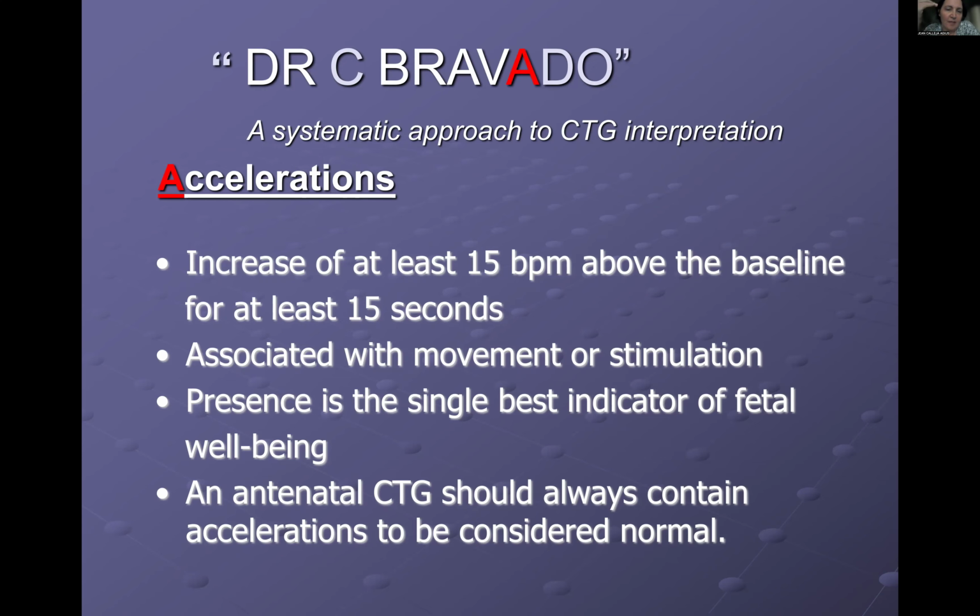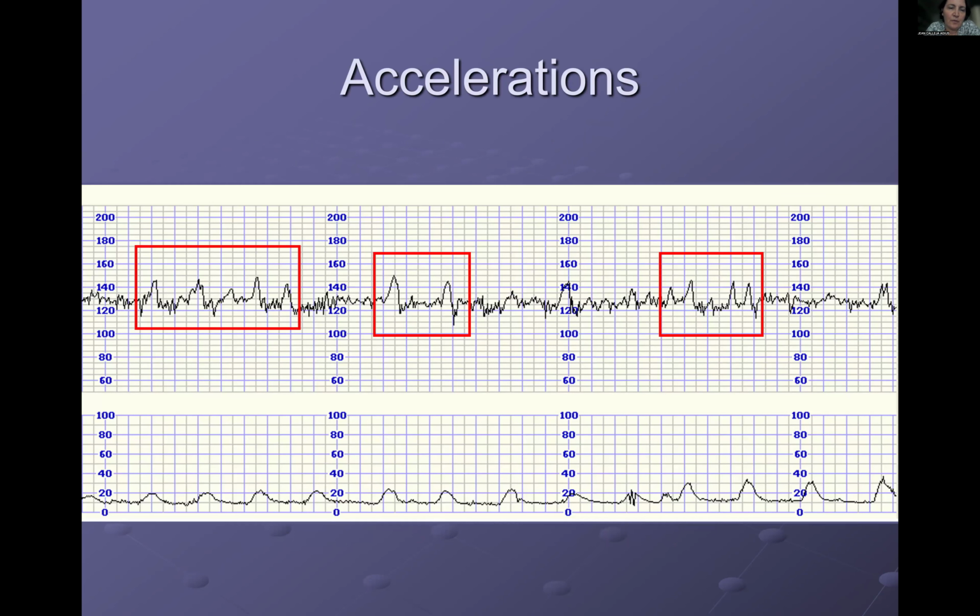And ideally, an antenatal CTG, right, should contain accelerations. Especially if she's in the early stages of labor or prenatally, like you're listening in. So normally, if a lady has come in, for example, because she hasn't felt the baby move and you're doing a CTG, as I said, you give her 20 to 30 minutes, like in this case, we give her 30 minutes. And just in case the baby happens to be a bit sleepy at this point, you keep on the CTG till you start seeing accelerations. Okay, so it's very important.